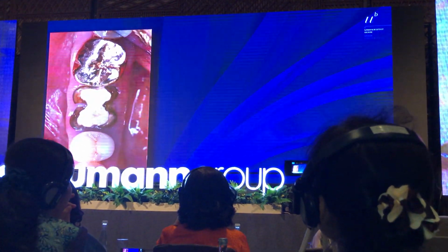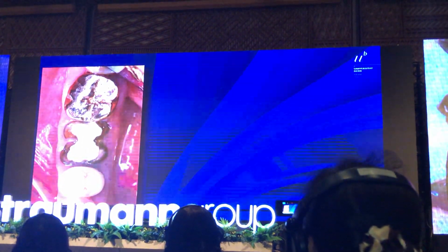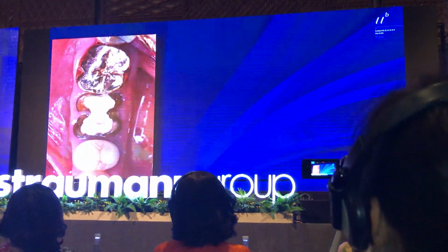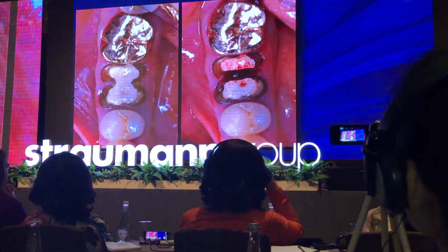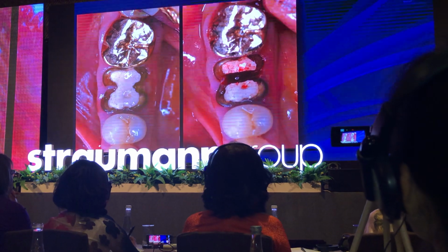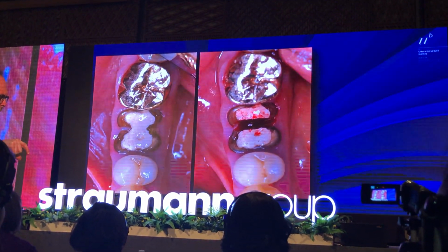And I showed you yesterday the patient with the computer-assisted surgery. Today we would do a case like this with socket grafting, computer assisted. That means you then have no flap elevation anymore. So you see how we did it at that time in 2004. You always remove these teeth with root separation, very important. So separate them so you get 2 roots off like a premolar root, so you can limit the trauma to the site.